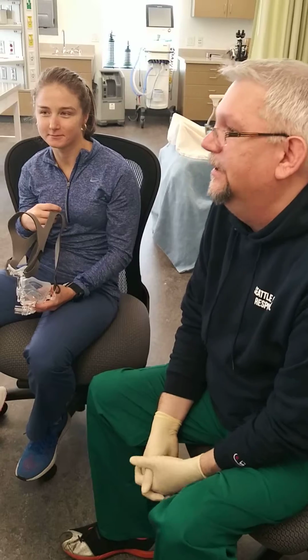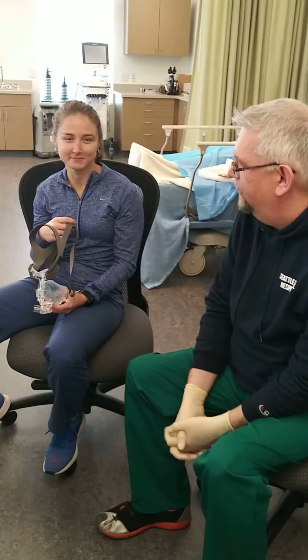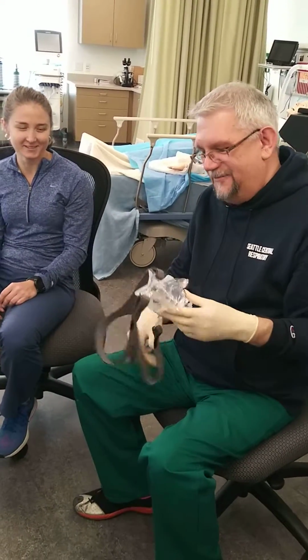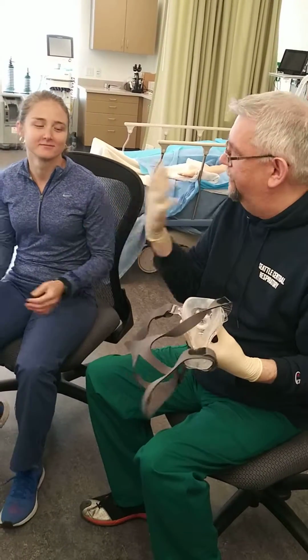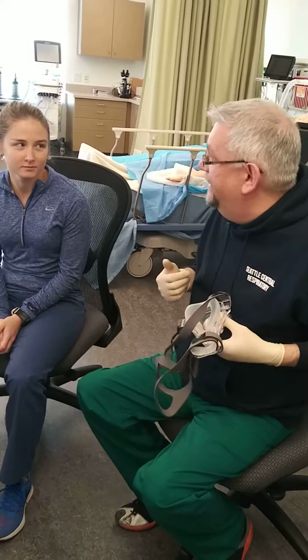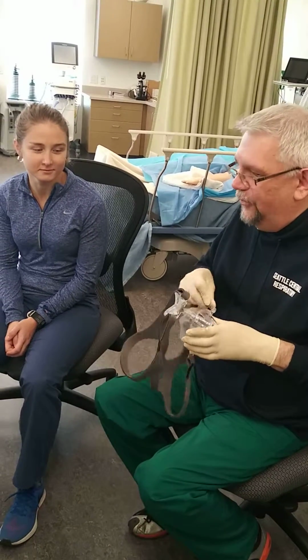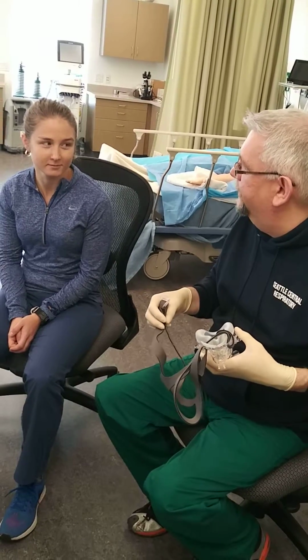Great. All right. So have you ever used a mask for your breathing before? No. Okay, well you already have it in your hand, which is unusual. So this mask is going to fit over your mouth and nose, okay? It's going to blow some air at you, and you may find that it feels like it's kind of trying to help you take a deep breath, okay? So it's a little bit unusual feeling, but we're going to take it slow and get used to it before I leave you and make sure you're totally comfortable before we do anything else, okay?